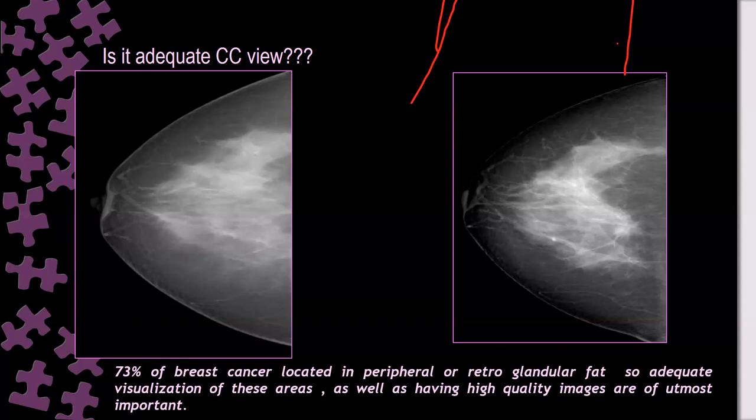Most of the time, if you have seen the pectoralis, you will see the end of the parenchyma. But if you did not see the end of the parenchyma and the nipple is really central, most likely if you draw the posterior nipple line, you will find it matches. Very unlikely.